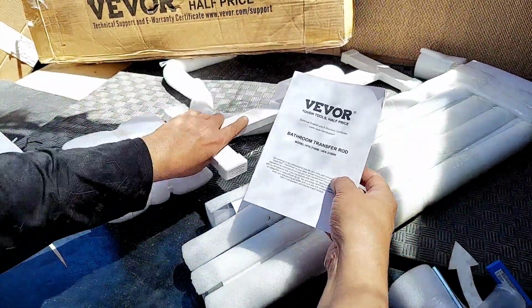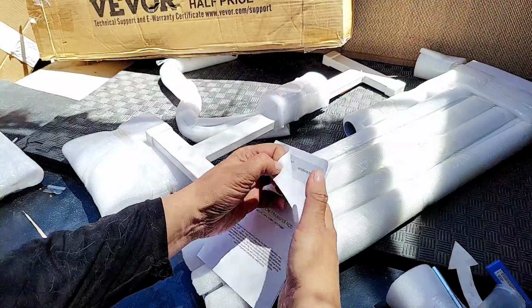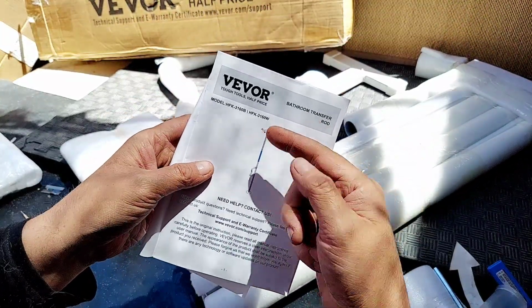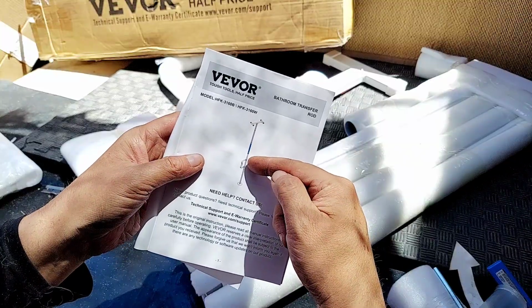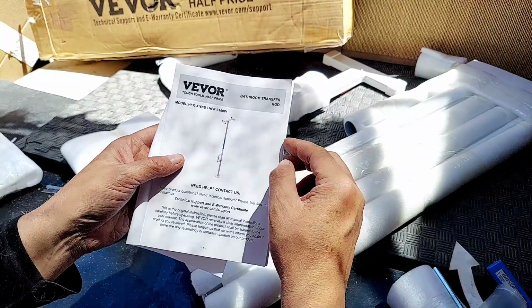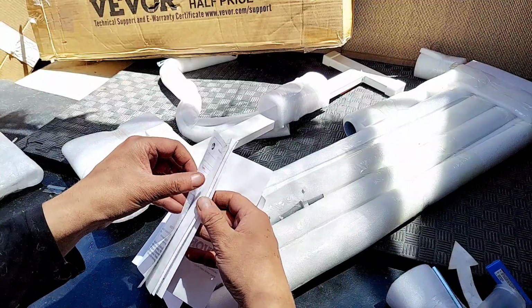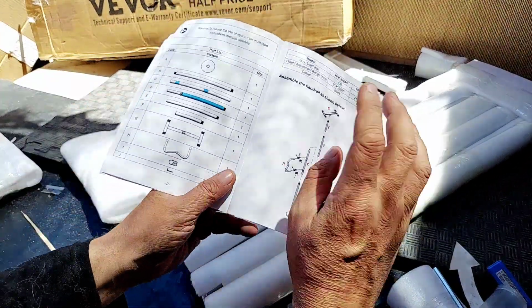So we've got the part that goes to the floor. Then we have a part that goes to the ceiling for support. And then we have a handle. There's also a foam section for holding on to. And this way you can move this and position it wherever you're going to need.